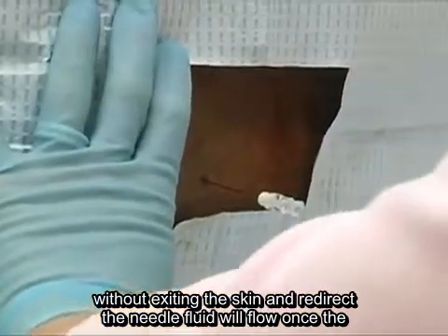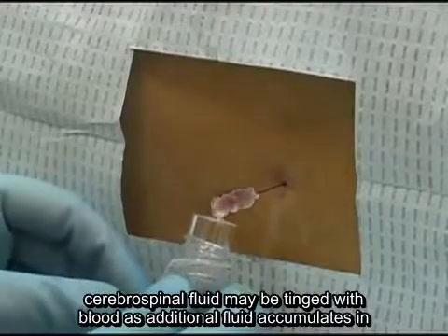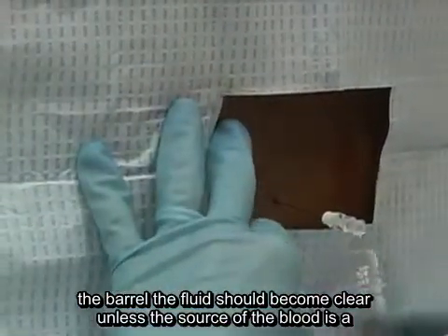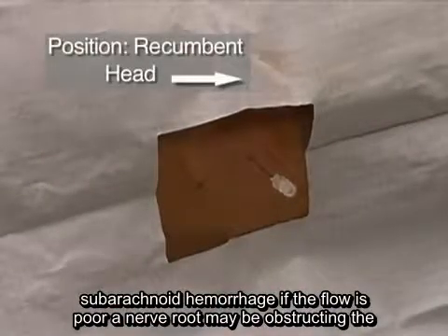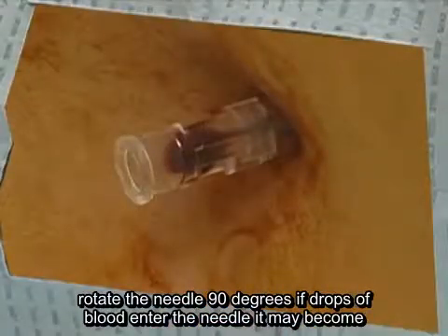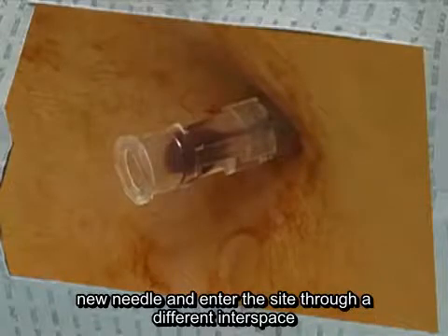Fluid will flow once the needle enters the subarachnoid space. If the lumbar puncture is traumatic, the cerebrospinal fluid may be tinged with blood. As additional fluid accumulates in the barrel, the fluid should become clear, unless the source of the blood is a subarachnoid hemorrhage. If the flow is poor, a nerve root may be obstructing the opening of the needle, and you should rotate the needle 90 degrees. If drops of blood enter the needle, it may become clogged. In this case, you should obtain a new needle and enter the site through a different interspace.